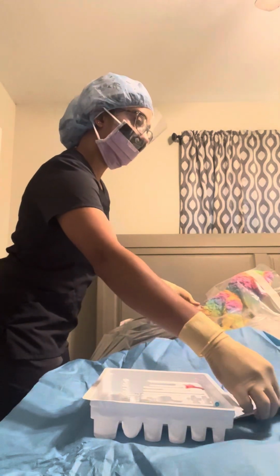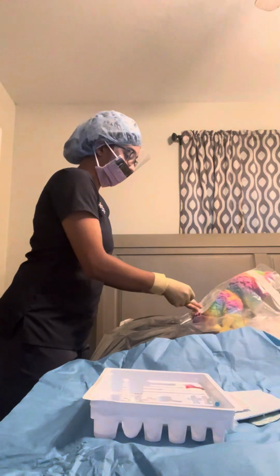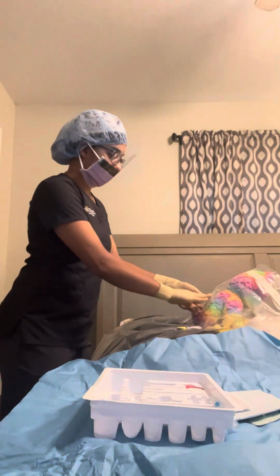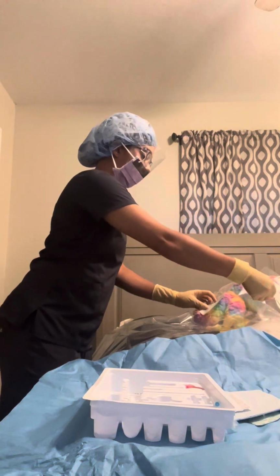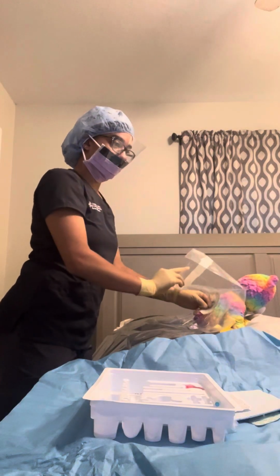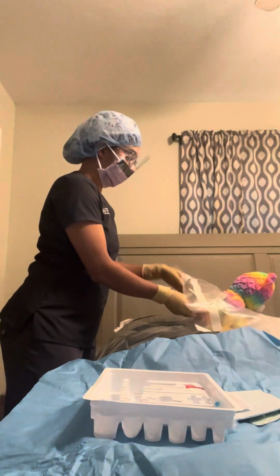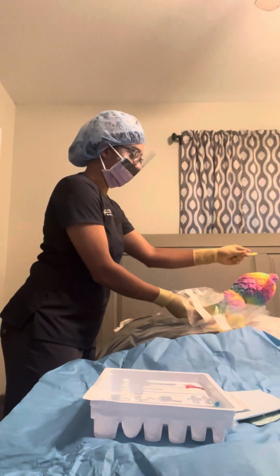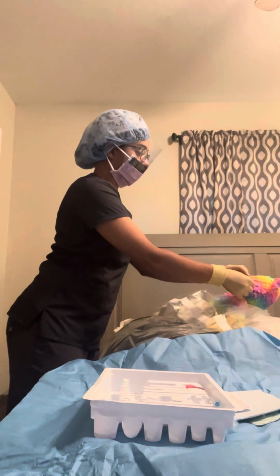I will apply a dressing to the epidural catheter. Allow the catheter to sit, and then secure it down to the patient, following the natural curvature of the catheter.